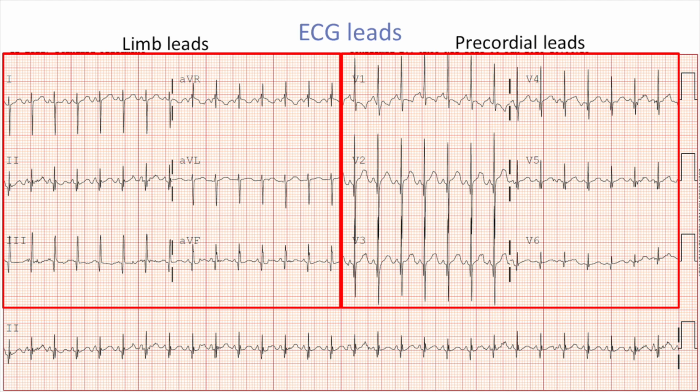The anterior, posterior, and horizontal right to left forces of the heart are detected here. In pediatric patients, 2 additional leads may be placed on the right side of the chest, opposite and symmetrical to lead V3 and V4, and are labeled V3R and V4R.